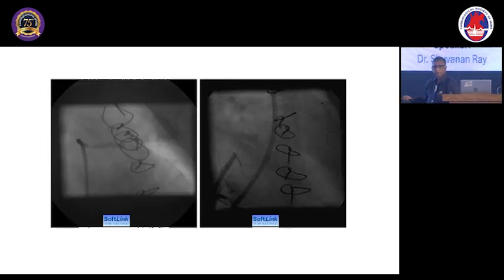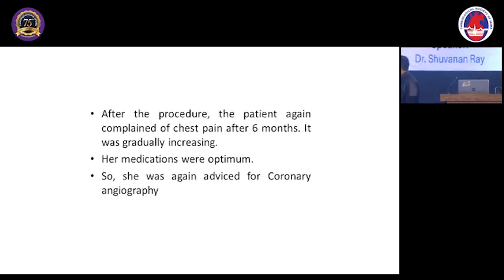What is this? You can see that there is some amount of dye in the ventricle. You see? The left ventricle is filling. When you give an angiogram here, the left ventricle is filling. Is it normal or abnormal? Please give them a mic. Is it normal or abnormal?